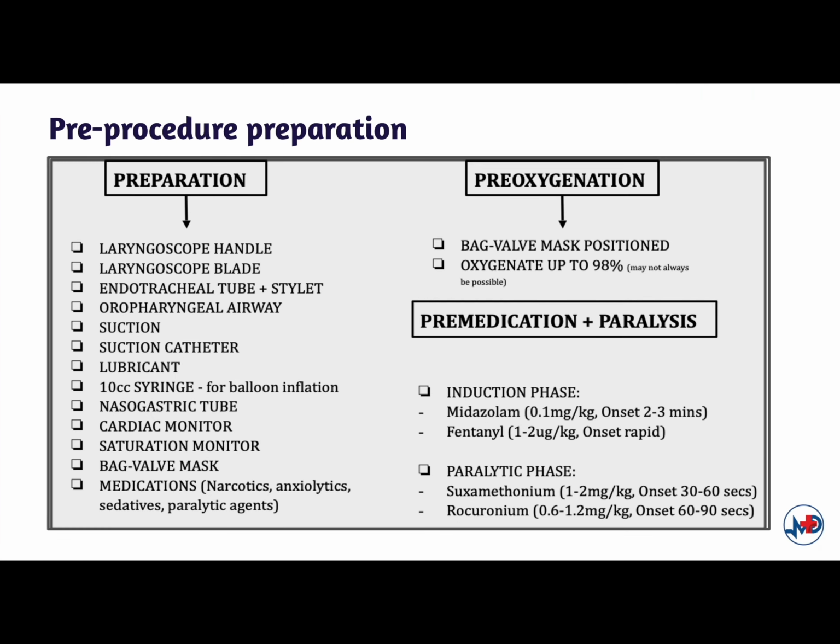Let's look at the pre-procedure preparation. So they are equipment preparation, pre-oxygenation, and pre-medication as well as paralysis.